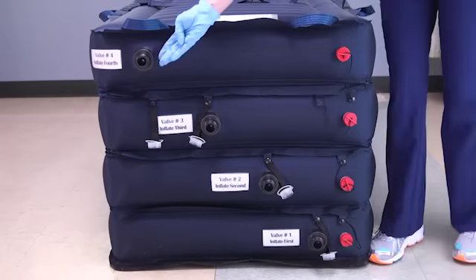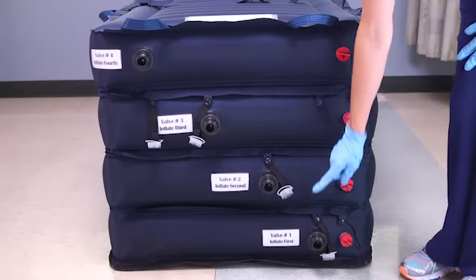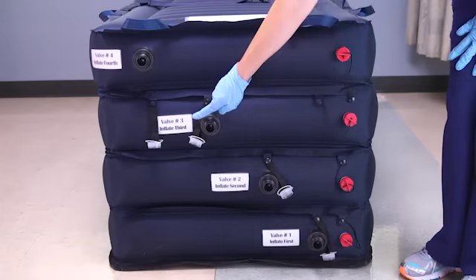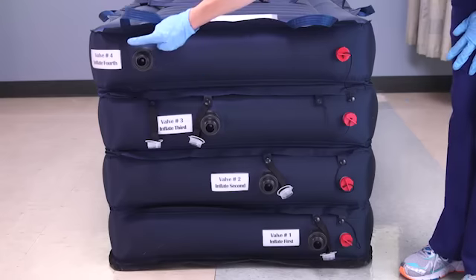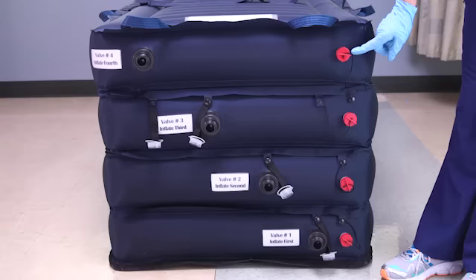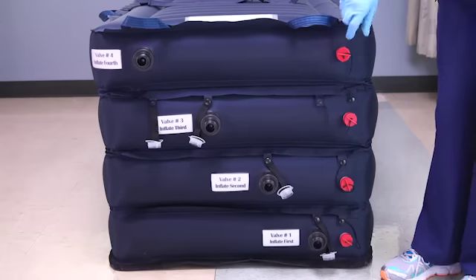Each one has a black, one-way valve through which the air supply inflates the chamber. The valves are labeled and numbered from 1 to 4, with the chamber labeled Valve 1 being the closest to the floor. Each chamber also has a red-capped valve to be used for quick deflation. Always recap these valves after using the HoverJack to ensure that they are closed for the next use.